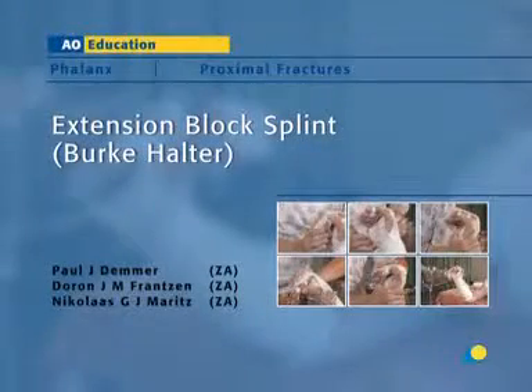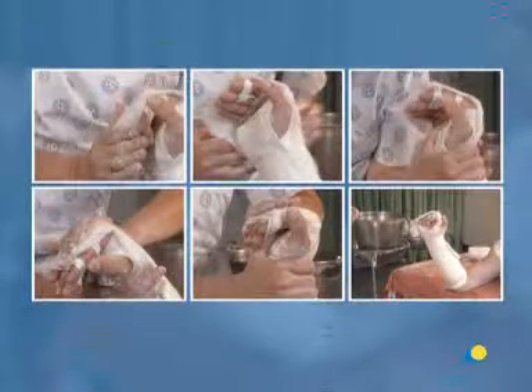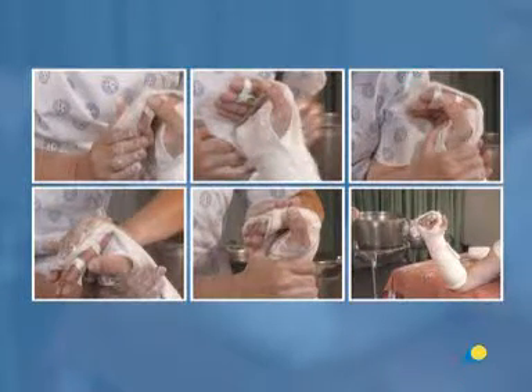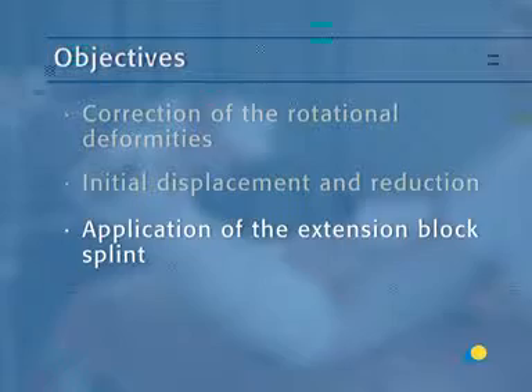The extension block splint, or Burke-Halter, is used to immobilize proximal phalanx fractures. In this presentation, the application of the extension block splint will be demonstrated. The objectives of the exercise are to understand the correction of rotational deformities, the initial displacement and reduction, and the application of the extension block splint.